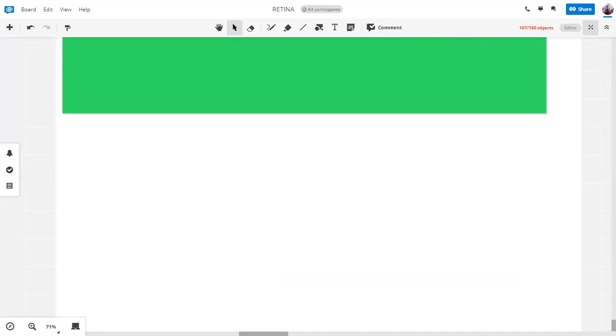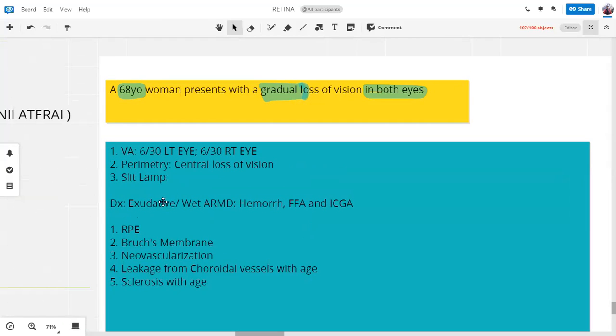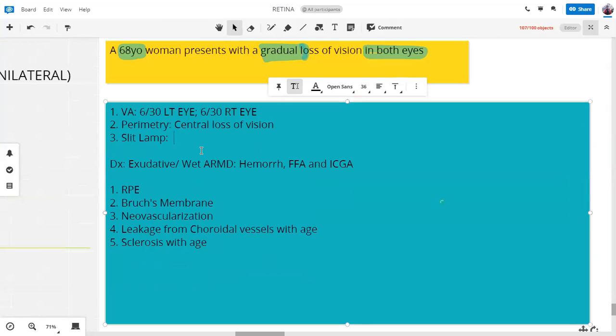That was the first question. I have already answered the second, what they are and how they appear. What are these spots called? Drusen. These are drusen. Very important, this is an important buzzword. Drusen. These are drusen around the macula. Around or at the macula.